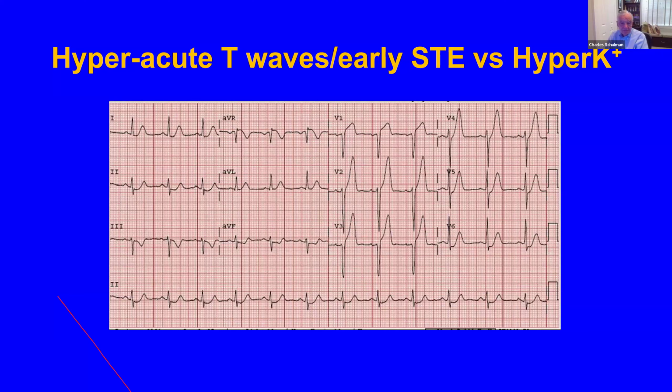What do you think? Hyperkalemia, says someone. Anybody else? Early STEMI, says someone. And okay, that is in fact the dilemma.